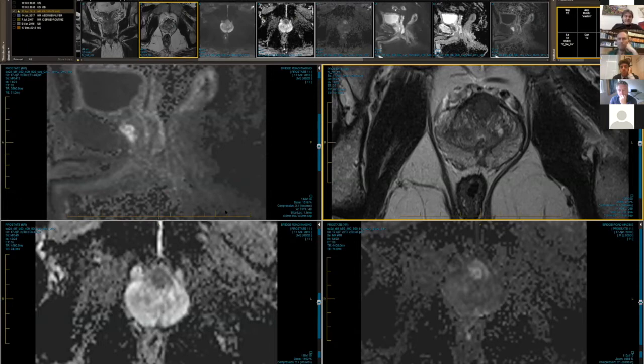Yeah. And in anterior lesion, I used to say to the trainees to go straight to the lesion, and if the lesion is paramedian lateral, to go on another access point of the skin, to go straight to the lesion and not to enter more paramedian to go lateral in this case. Right. Yep. And how easy do you think it is for trainees to pick it up? Or do you think this is quite a challenging skill to pick up?